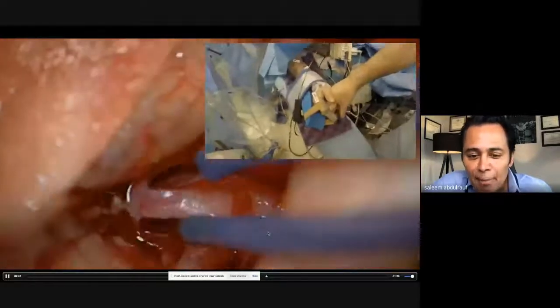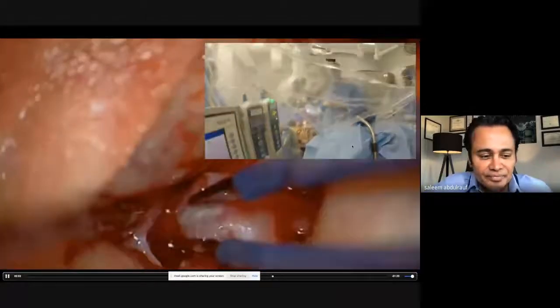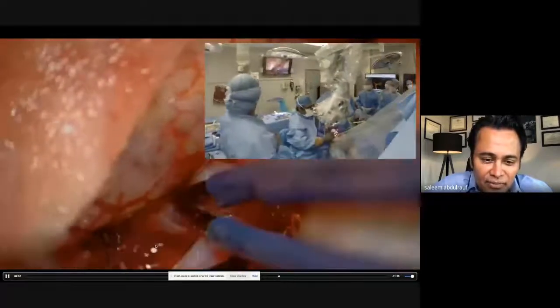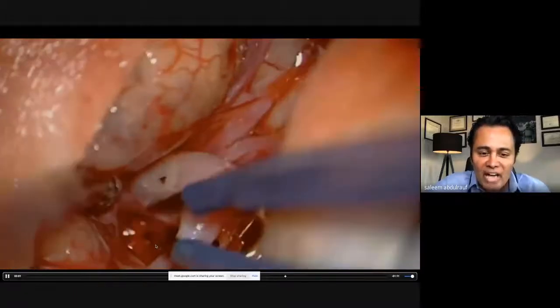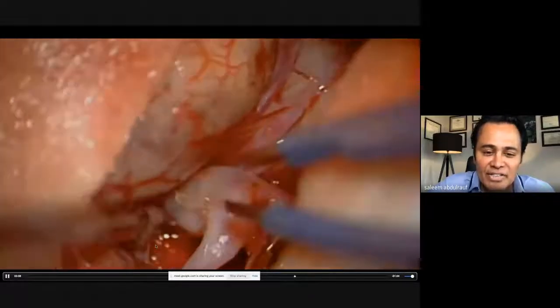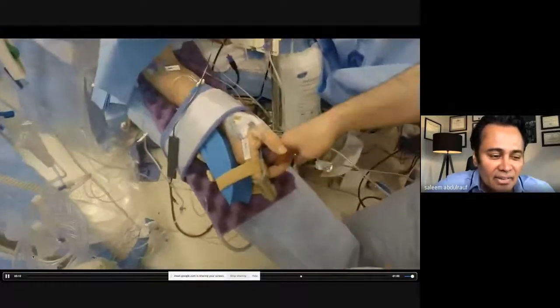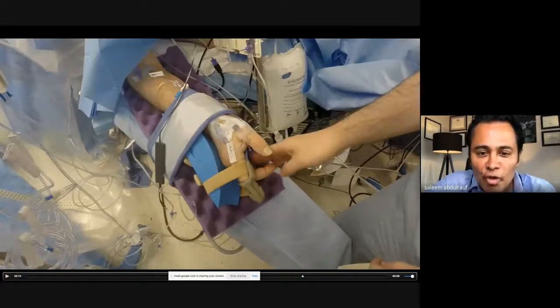Excellent. I put a temporary clip on the M1. The guy is squeezing his hands. So I shrink the aneurysm to get the good neck right there. Okay, this is in real time. Watch what happens in 30 seconds. I told you everything happens within 60 seconds. Within 30 seconds, right now, you will see the guy, as I told you before, he cannot move. He said, I cannot move my hand.